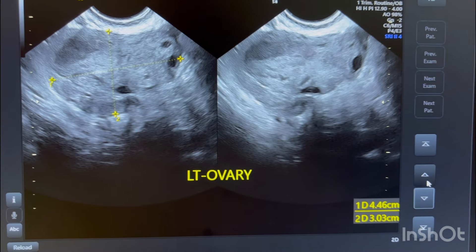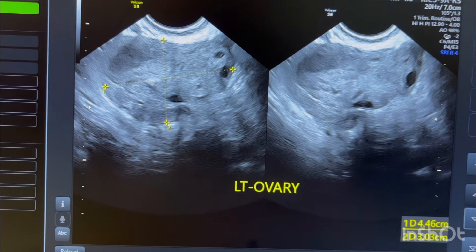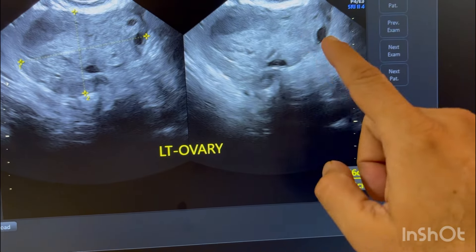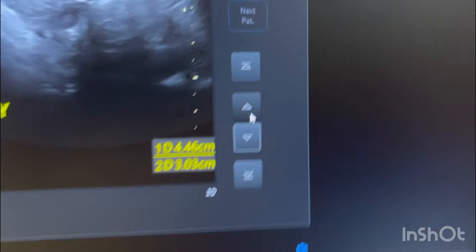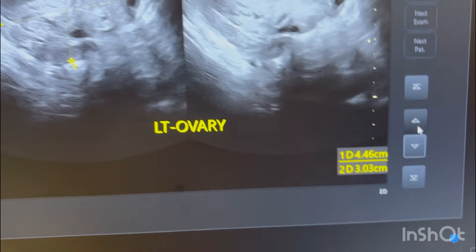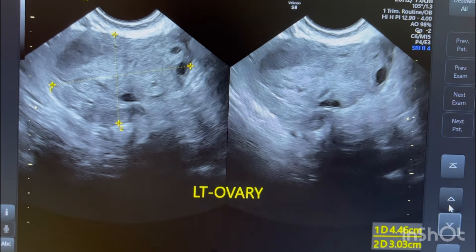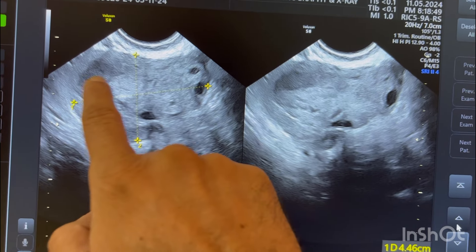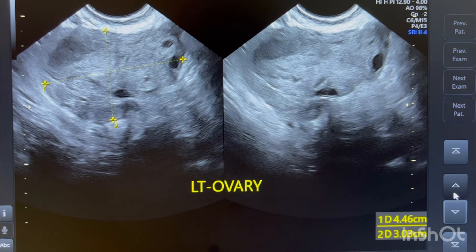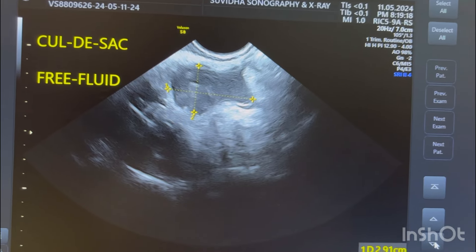The left ovary is enlarged and shows an echogenic cyst with internal homogeneous echoes — consistent with an endometriotic cyst. The left ovary measures 44 by 30 mm, relatively enlarged compared to the right. These findings — the echogenic cyst and ovarian enlargement — are in favor of PID.